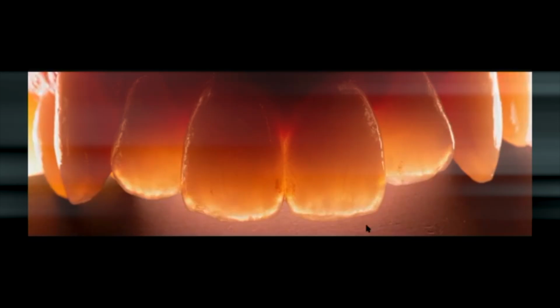Remember, it's not so much about the pigments or the colors, especially when we talk about composite. Composite has a very high capacity to blend regarding color and pigment. Even if our composite is not exactly the same pigment or shade as the tooth, it tends to blend very easily when we have the right opacity. If we don't have the right opacity, then it doesn't blend.